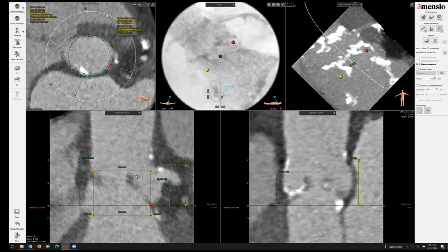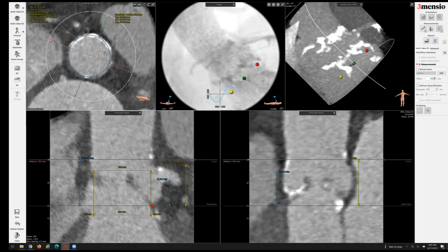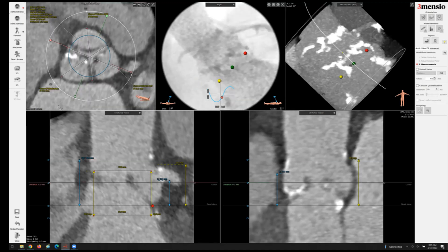In situations where the leaflet tip is bulky or calcified, there's certainly a risk of coronary obstruction. If I go up to the sinotubular junction, the average diameter is 23.6 millimeters, and I superimpose a 23-millimeter circle — you can see there's not a lot of room here. Going to the sinus of Valsalva, the sinuses are large: 31 millimeters facing the left sinus, and 28.9 millimeters facing the right coronary sinus.